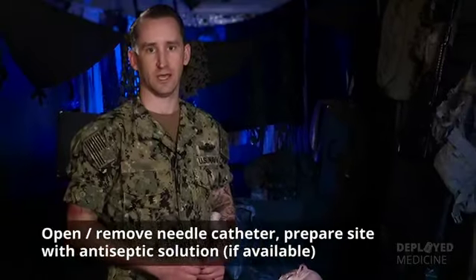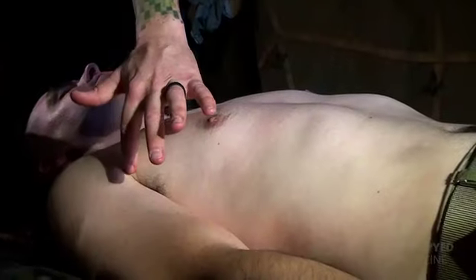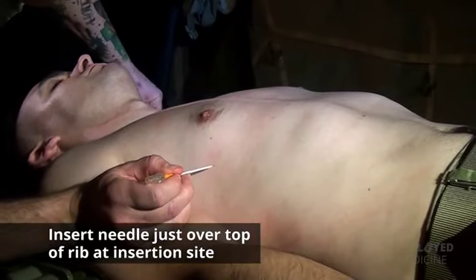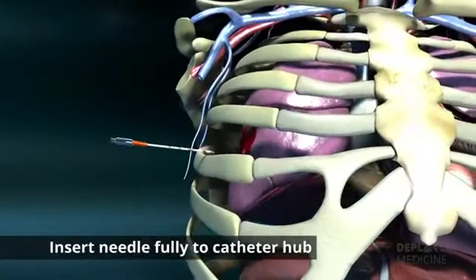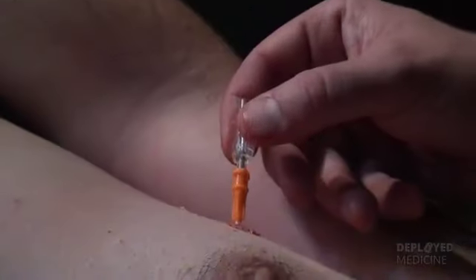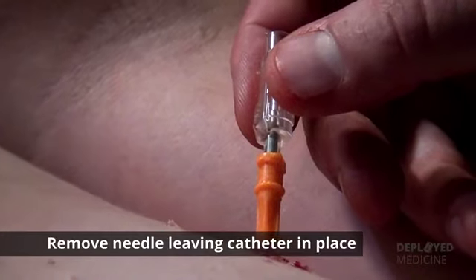Once you've identified the site, take your 10 or 14 gauge 3¼ inch needle catheter and begin your insertion. Following the anterior axillary line, I'm going to insert my needle just over the top of the lower rib at the insertion site. Insert the needle catheter unit all the way to the hub and hold it in place for 5 to 10 seconds to allow decompression to occur. After the NDC has been performed, then remove the needle, leaving the catheter in place.